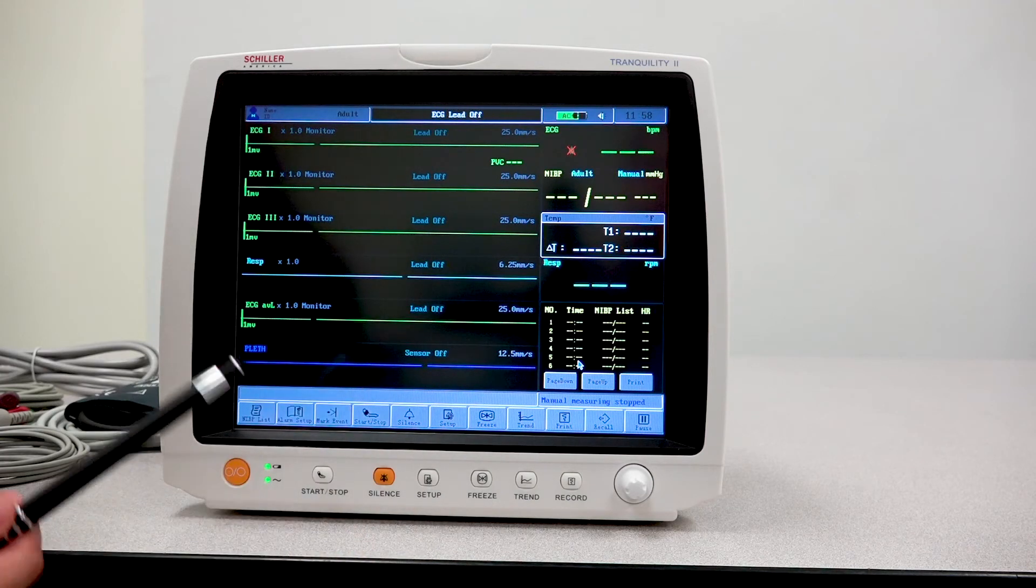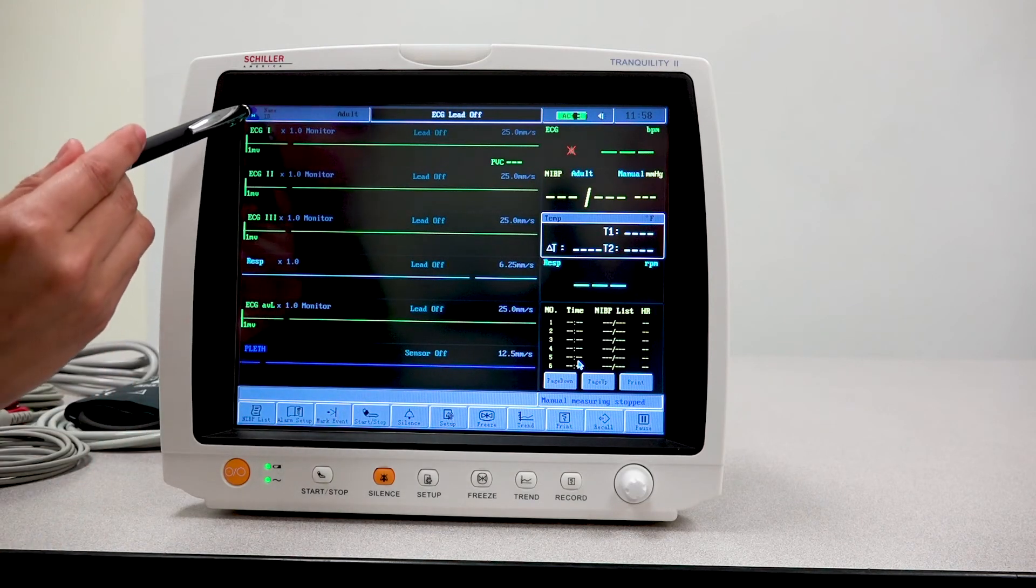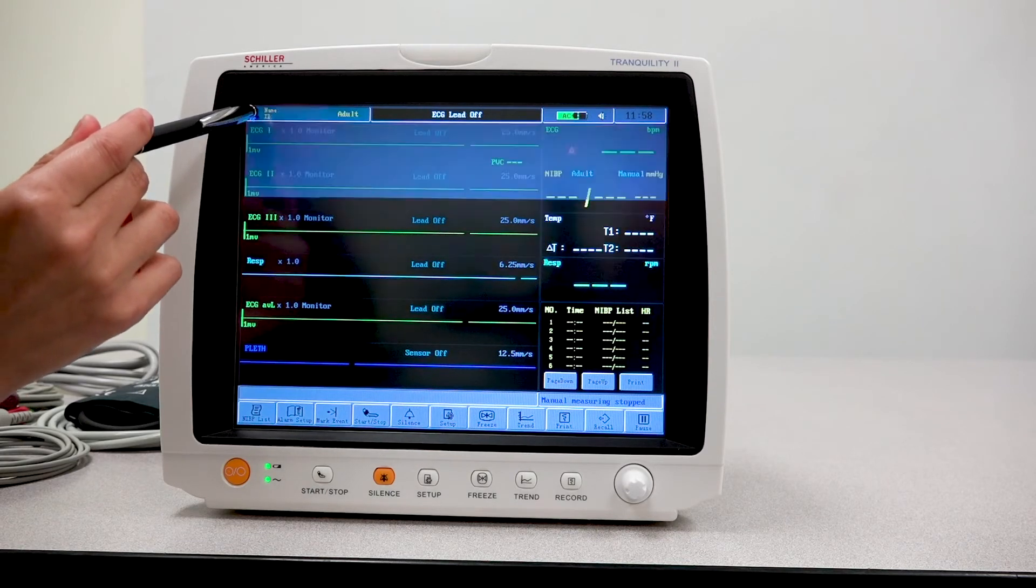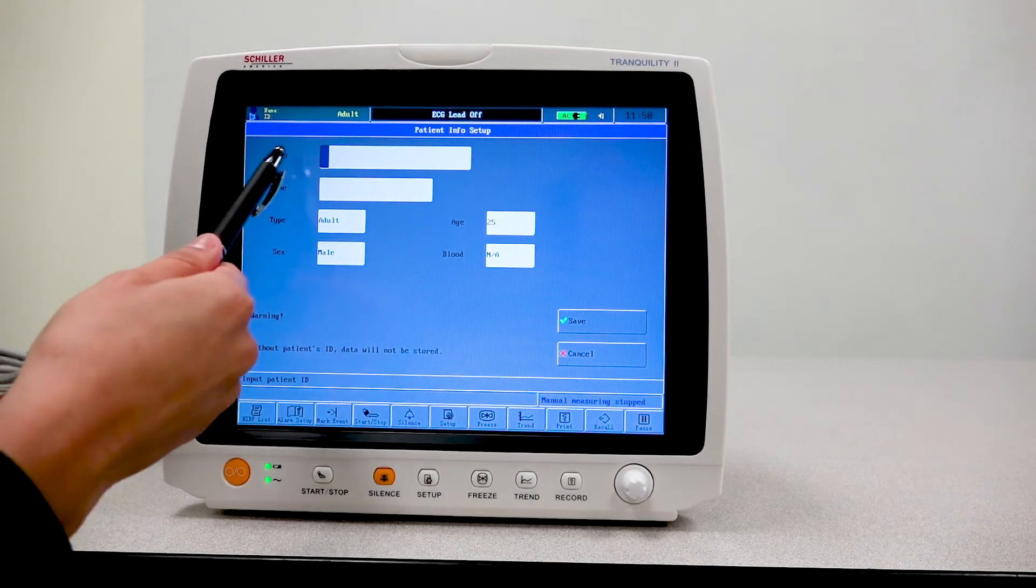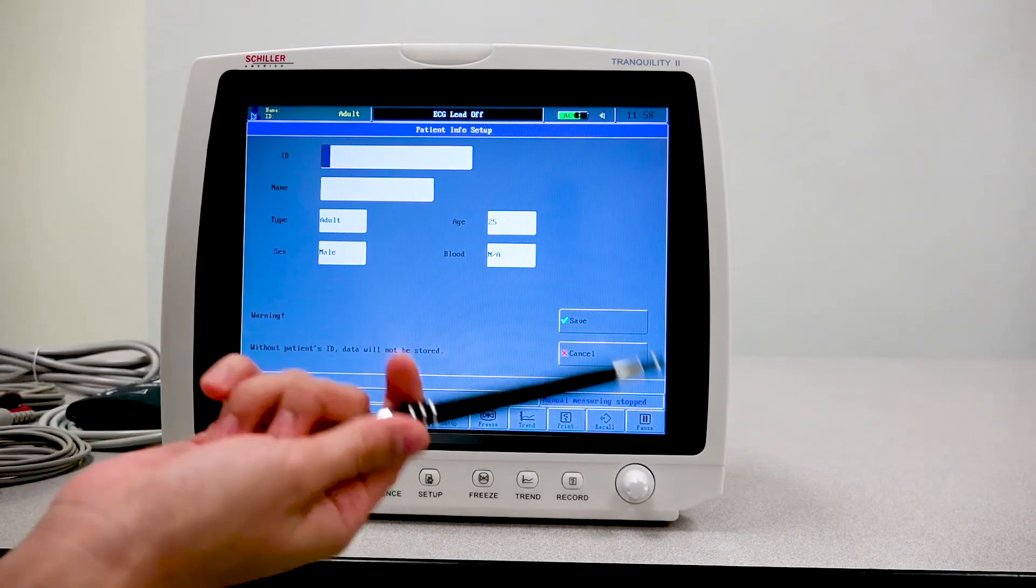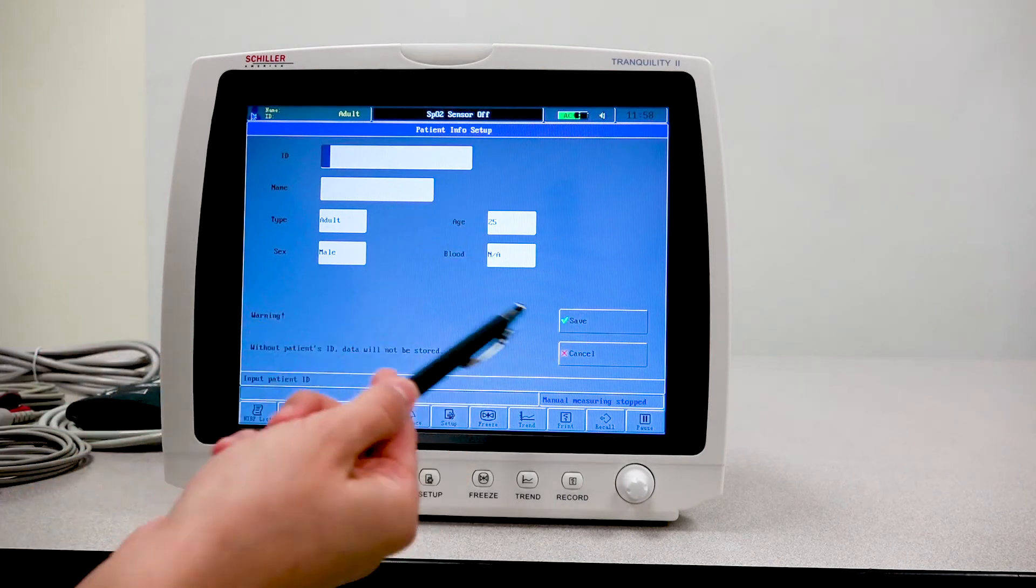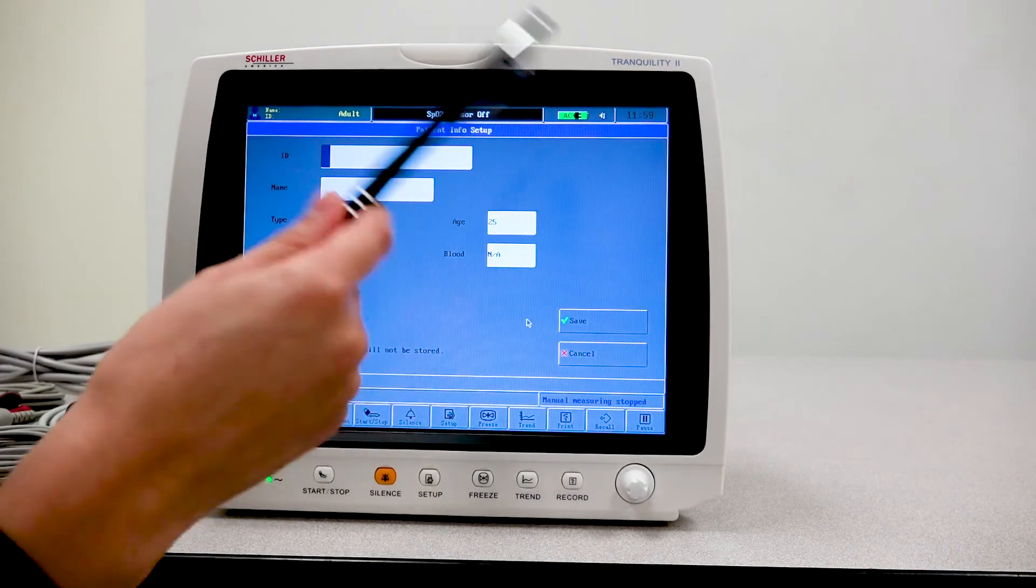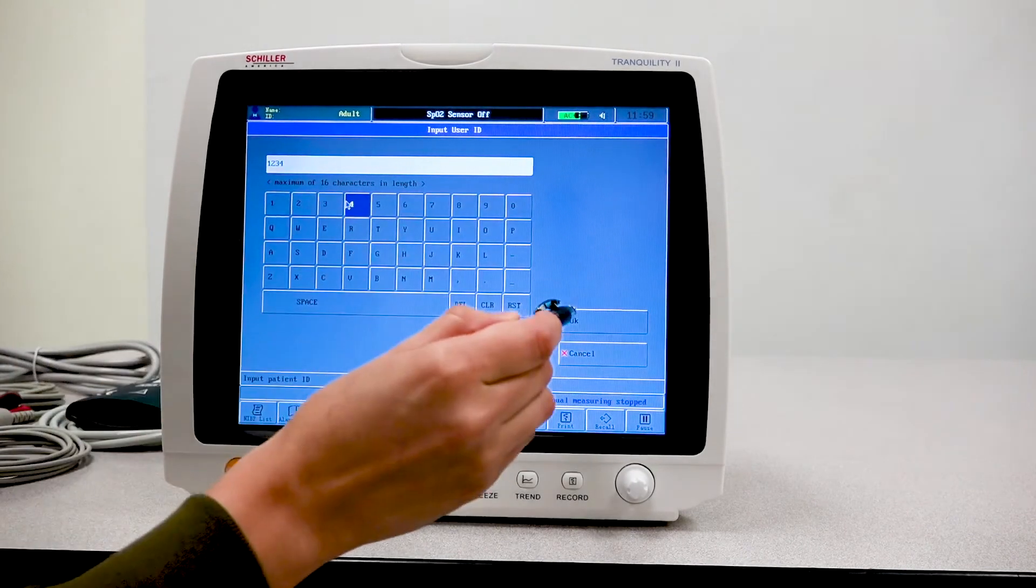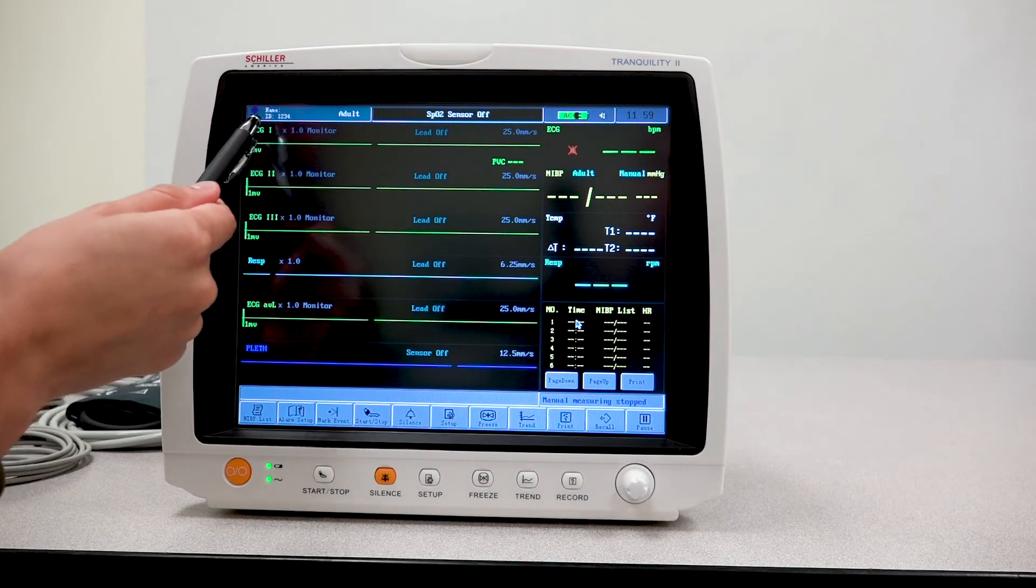The next thing I want to show you is that if I was hooking up a patient to this unit, I will go here to the top left corner of the screen where I have my patient icon. I press on that. And here I am able to enter my patient information. I can create the patient ID, enter their patient name, select what type of patient, the gender, the age and even blood type. Once you enter all of the information, you'll press save. And now you'll notice the patient information up here.